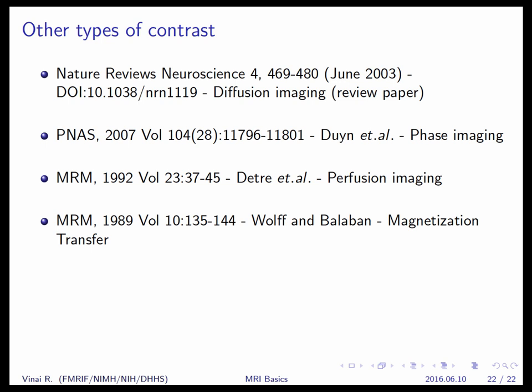There are also different techniques for imaging how much water, how much perfusion is happening to different brain tissues. Again, Peter mentioned earlier magnetization transfer, in terms of looking at the protons in these large pools of proteins that may not resonate exactly at the water frequency, but they're a little bit off. And there are all these different techniques that you can use to explore all these different pools of protons with slightly different properties. And what's actually really cool about the NIH is that a lot of these folks either are still here or were here.